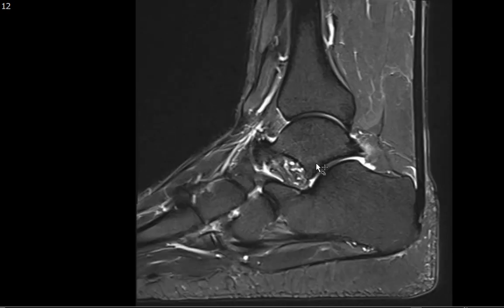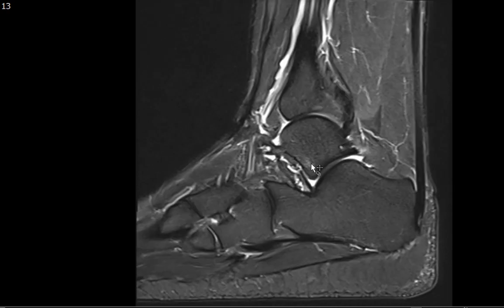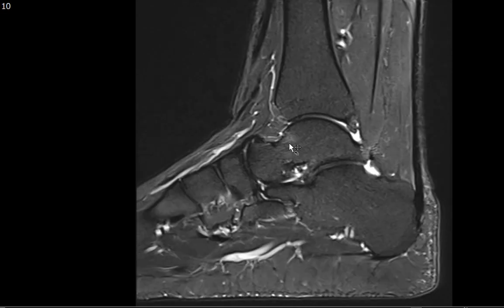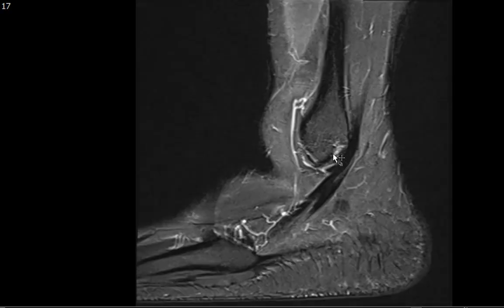I then turn to the talus, and if you take a look here, there is some minimal patchy marrow edema along the lateral process of the talus, and a little bit maybe at the talar neck. It's very faint and subtle, but there is some minimal T2 hyperintense marrow edema. The rest of the talus looks good.